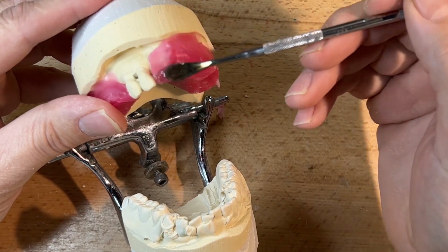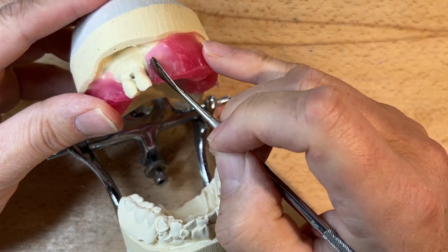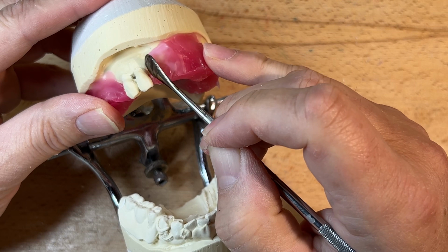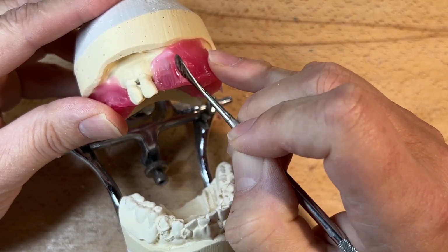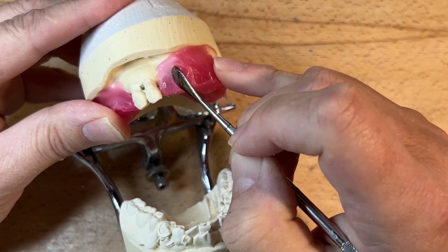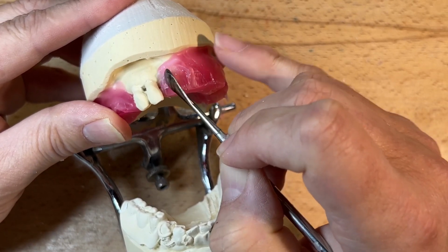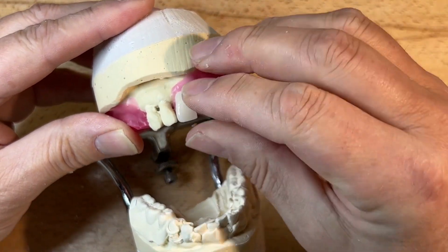So this is what I see in dentures, and the client tries to stress their need for aesthetics, but unfortunately we're trapped with the function of a complete denture. This is a complete denture without any implants. And we have to keep this overbite and overjet to a minimum.